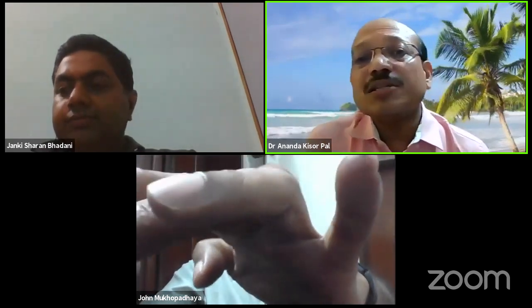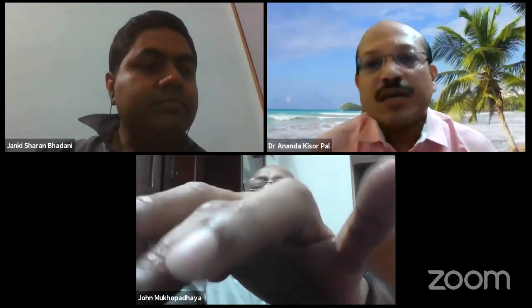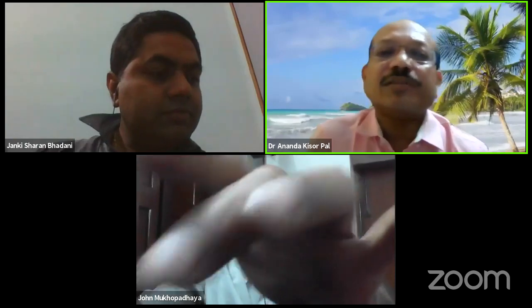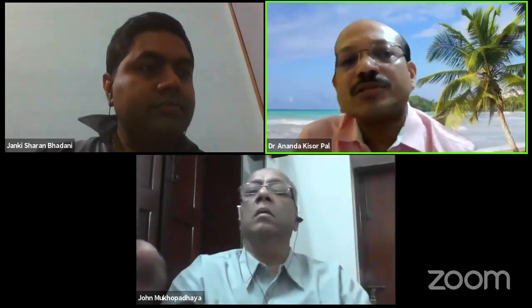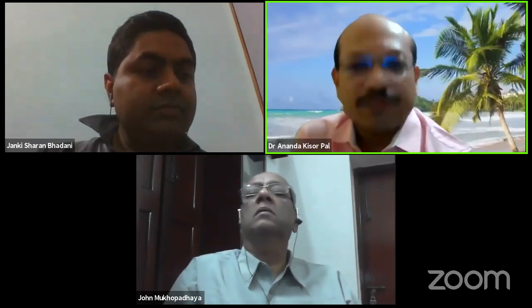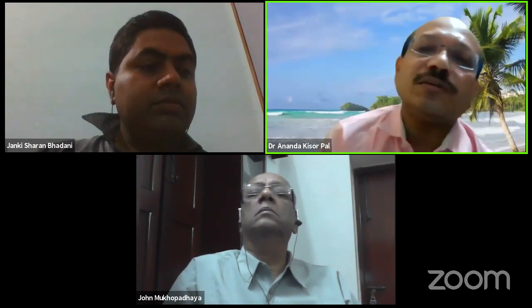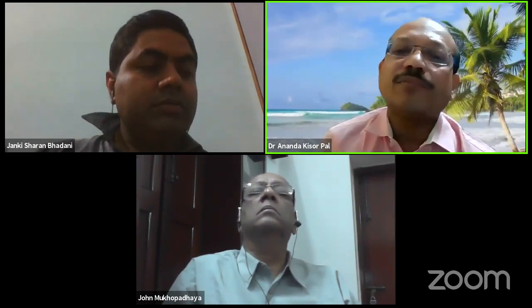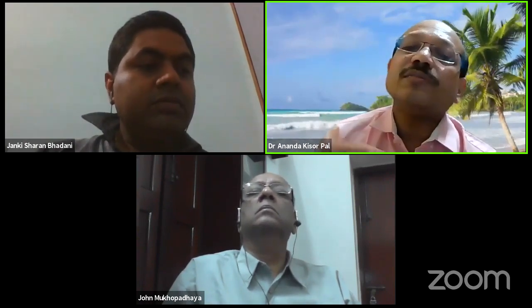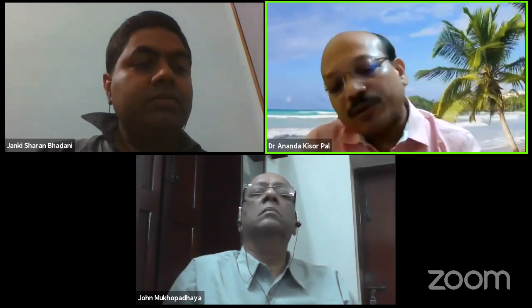Initially, a silicon layer is given, and over this the socket has total contact. Basically over the bony areas, like for the transtibial prosthesis, over the patellar tendon and also the head of the fibula. Every ups and downs of the amputated part of the limb should be covered, so that it has total contact.